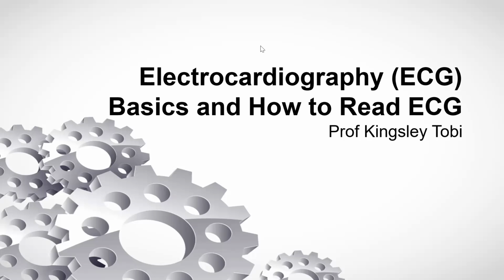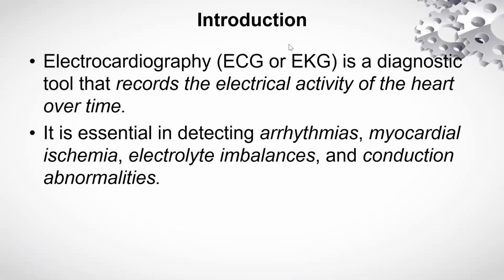Okay, so our learning objectives, or learning outcomes, at the end of this tutorial, every participant should be able to understand the basics of ECG or EKG as it may be called. All right, be able to understand the indications and should be able to read, number one, to identify life-threatening ECG changes on our monitors and to also be able to action appropriate interventions.